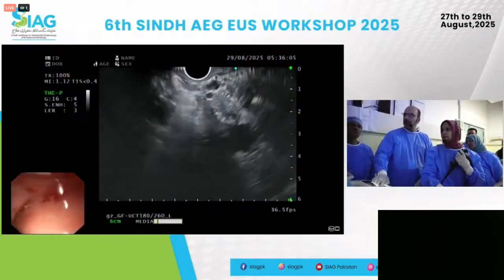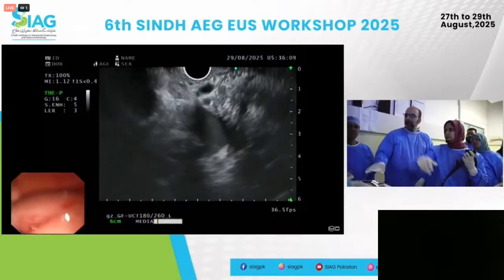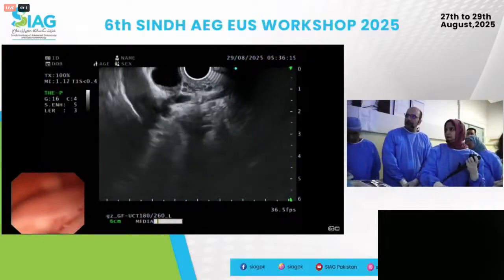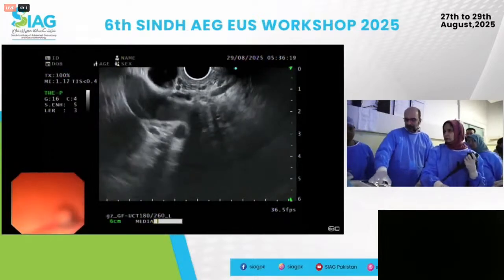And this looks like a PD to me, which is rotating around. Well, we haven't done much rotation. Why don't you follow this counterclockwise? Up into the left. Where is that going? It's going just behind the portal vein.